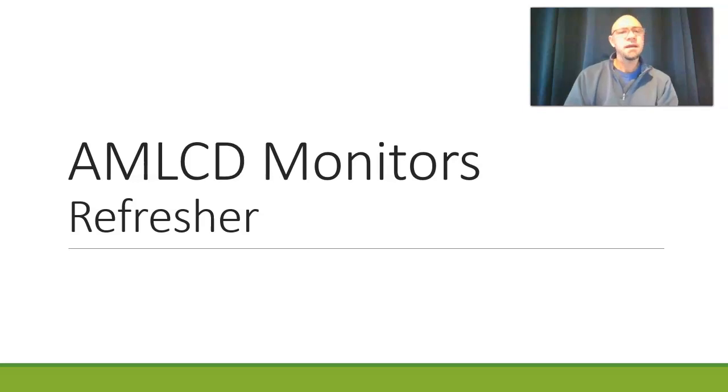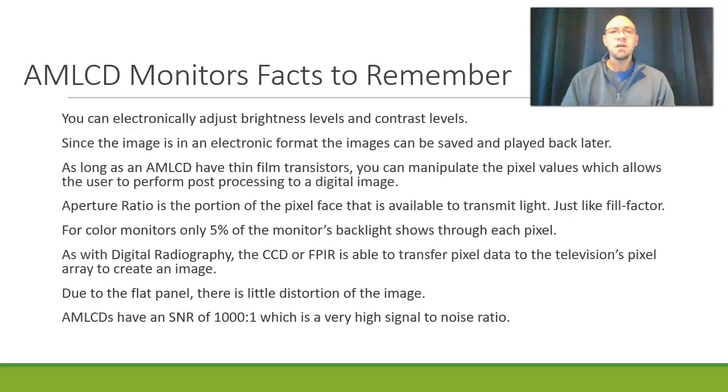Hey everyone, Joe back, and we are looking at lecture 1.6 for module 1 in RAD104. And in this lecture, I want to talk to you about the monitors that we use to show the fluoroscopy that we're doing.